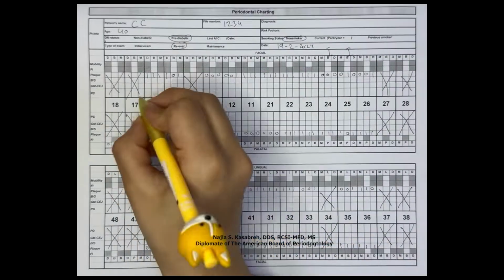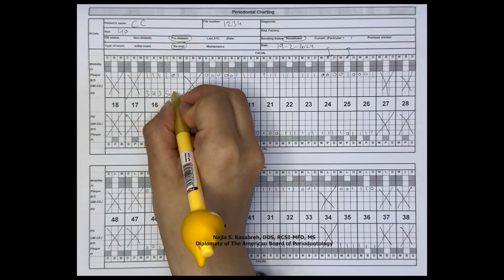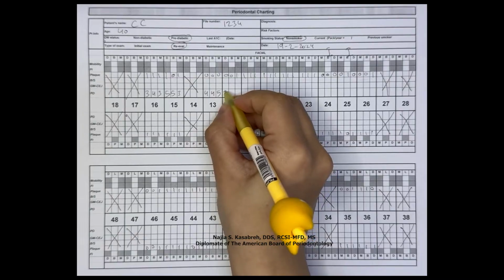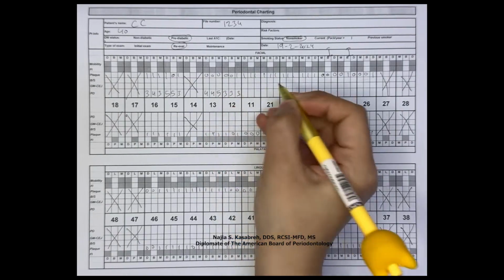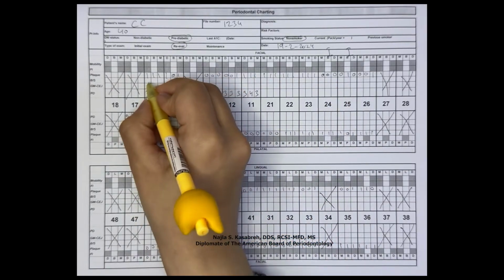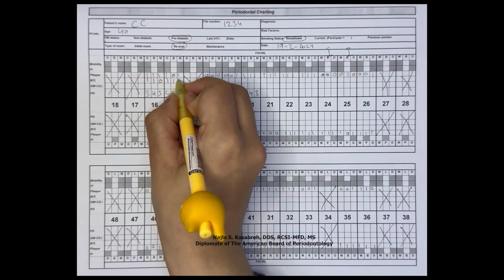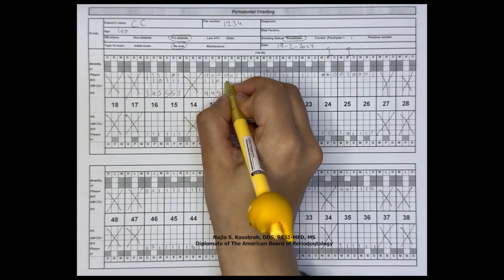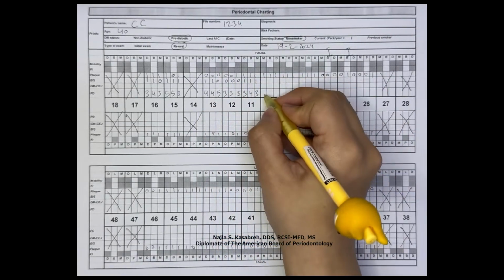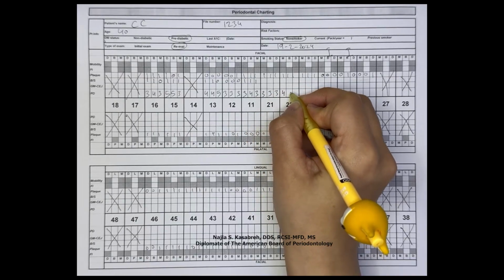The subsequent step involves recording the probing depth and assessing bleeding on probing. Begin once more from the upper right last tooth, probing the buccal surfaces until reaching the midline. Check for any signs of bleeding and report a 0 value if bleeding on probing is absent and 1 if present. Subsequently, continue to the buccal side of the upper left quadrant, followed by the same sequence of charting mentioned before. After completion, calculate the percentage of bleeding on probing using the following equation.